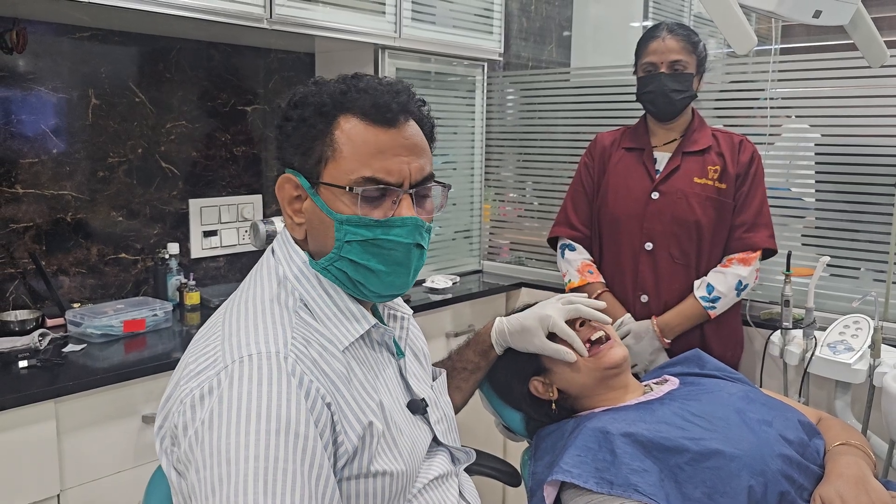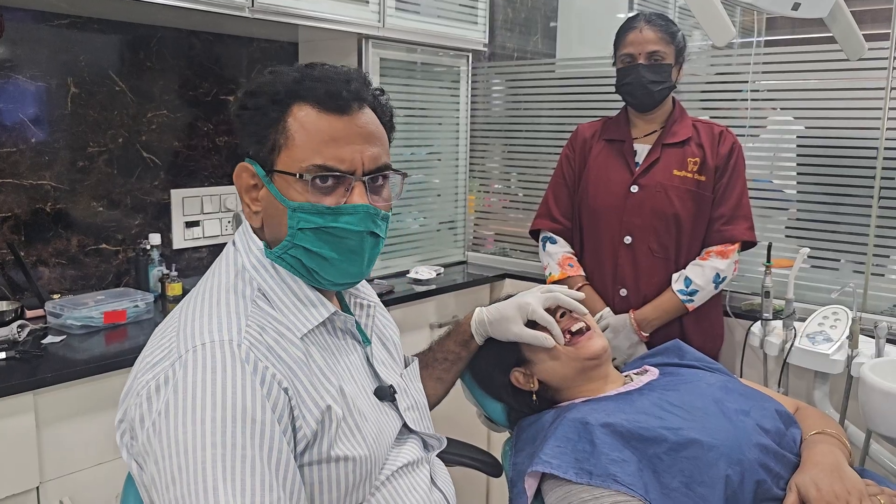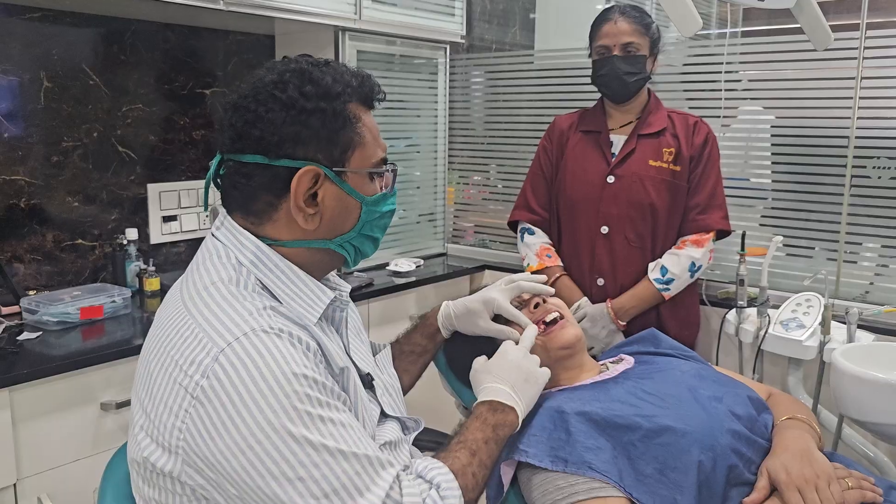Hello everyone, this is Dr. Durga Prasad. Today we are going to see immediate extraction and implant placement with basal implants in an upper right maxillary canine.